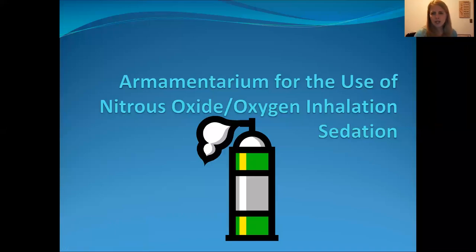This is the second video for nitrous oxide, and we're going to be talking about the armamentarium for the use of nitrous oxide, oxygen inhalation, and sedation. So in dentistry, we use nitrous for conscious sedation, relative analgesia, inhalation sedation, or the altered state of consciousness. We are particularly looking for the four A's, which we talked about in the last video, which are analgesia, anxiolytic, anesthesia, and amnesia effects from nitrous oxide.